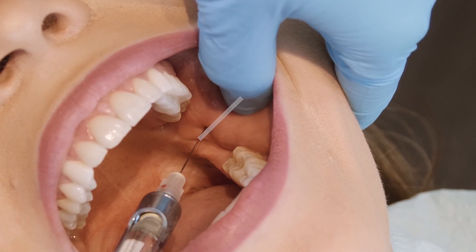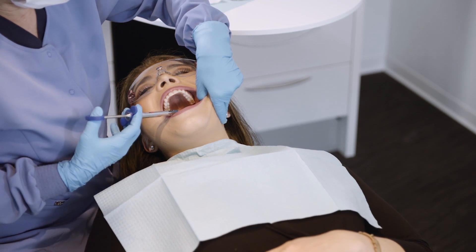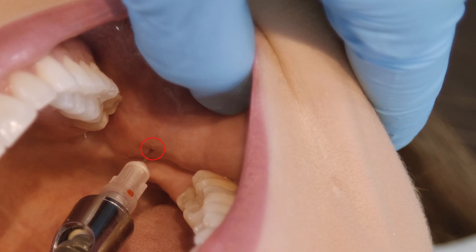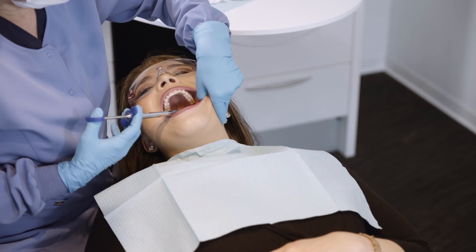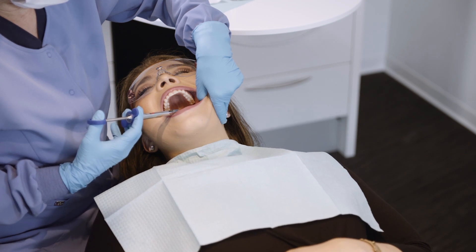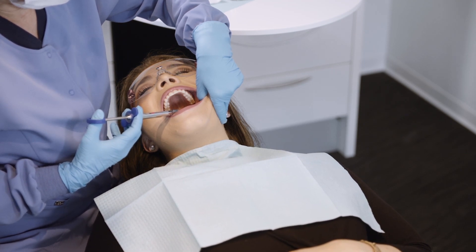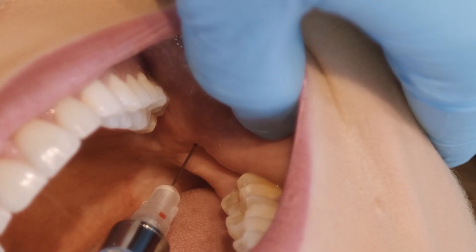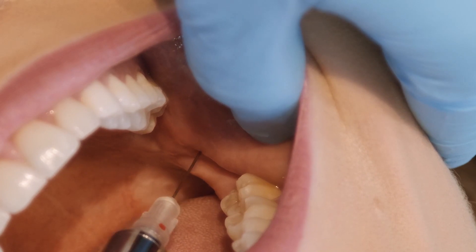The needle is then inserted slowly through the mucosa and buccinator muscle into the pterygomandibular space. A few drops of anesthetic solution delivered as the needle is advanced may help reduce the discomfort of needle insertion. Once bone is contacted, after an insertion of 20 to 25 millimeters, the needle is withdrawn slightly and an aspiration test is performed.